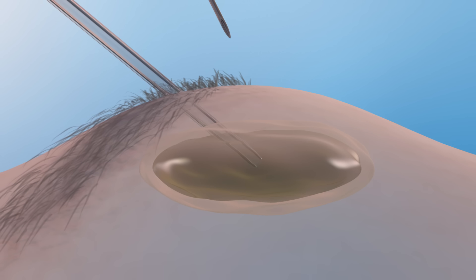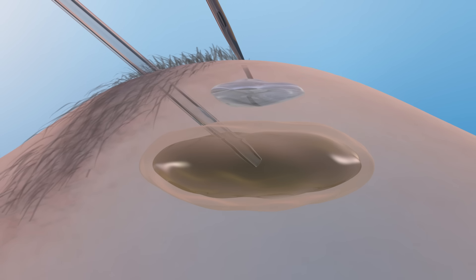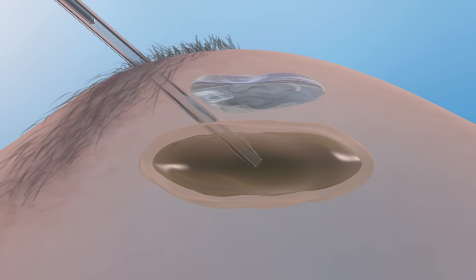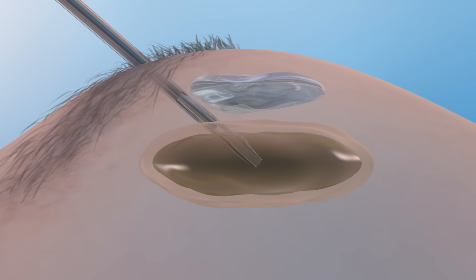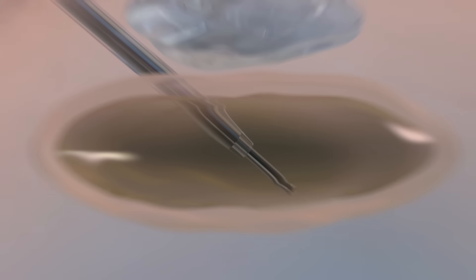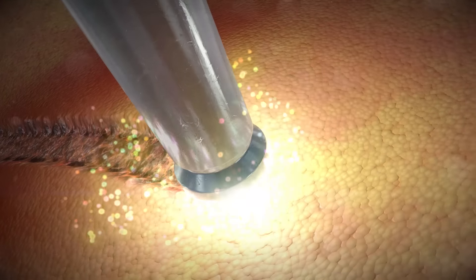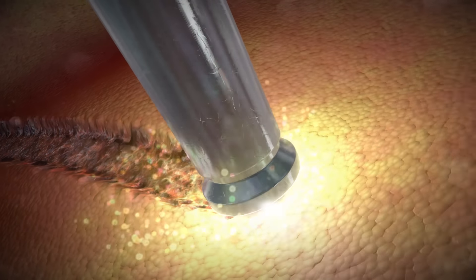A small amount of water is injected over the dermoid cyst to insulate and protect the skin. Next, ultrasound imaging is used to guide a radio frequency coblation wand through the angiocatheter into the cyst. The wand causes tightly focused heat to kill the skin cells lining the cyst.